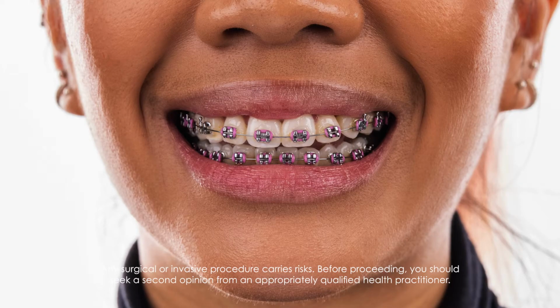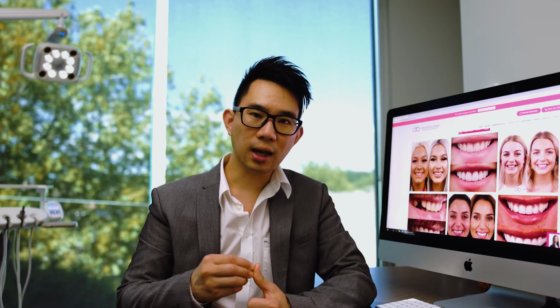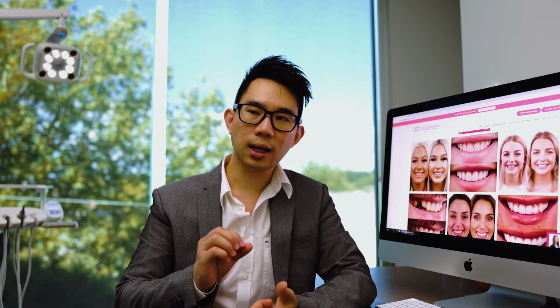Now, the other point about braces as well is that because they're made of wires, with a lot of wires around the area and brackets on the teeth, you may experience more discomfort potentially compared to any clear aligners out there. A lot of my patients, when they do braces, will come back with some ulcers, and the discomfort is slightly more marked compared to clear aligners. So the reason why some patients would prefer to do braces is due to the fact there's less compliance needed on their part, or when clear aligners like Invisalign cannot be used to move certain teeth.